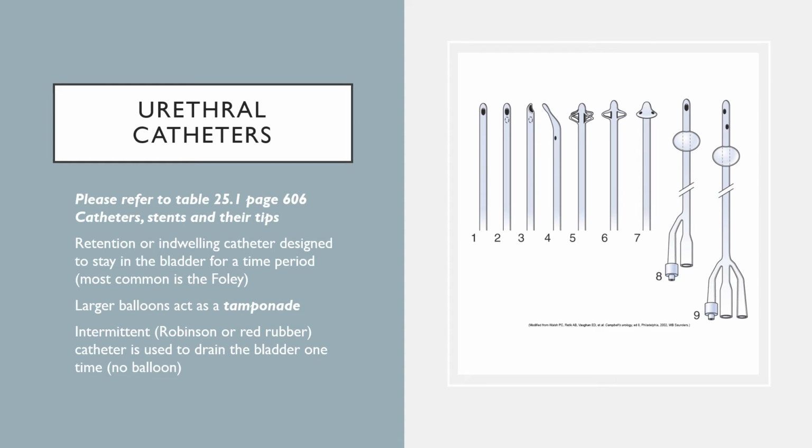All right, moving on to talk about some urethral catheters. There is a table on page 606 that is catheters, stents, and their tips. I would ask that you refer to that to get a good explanation and some diagrams.